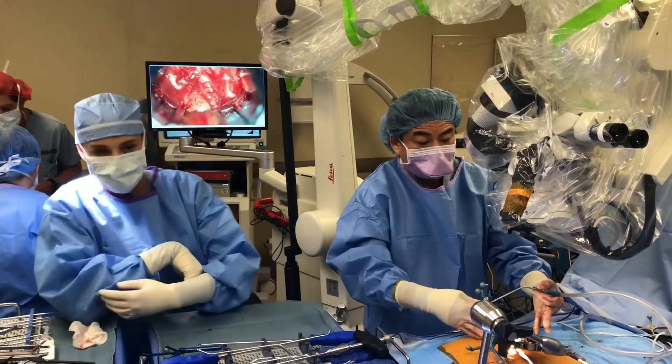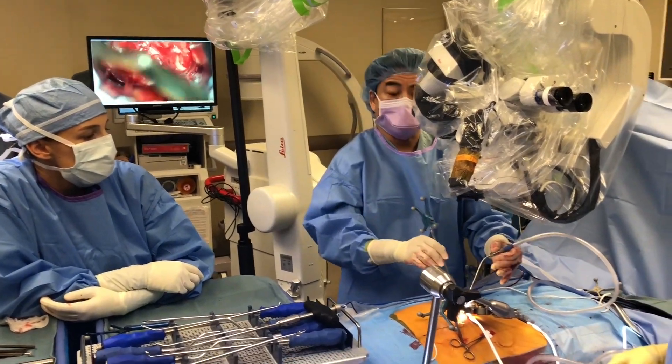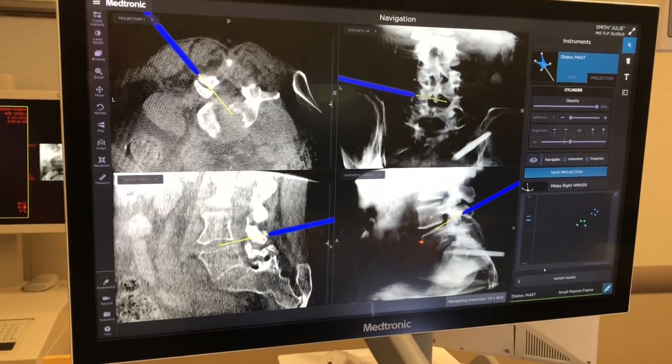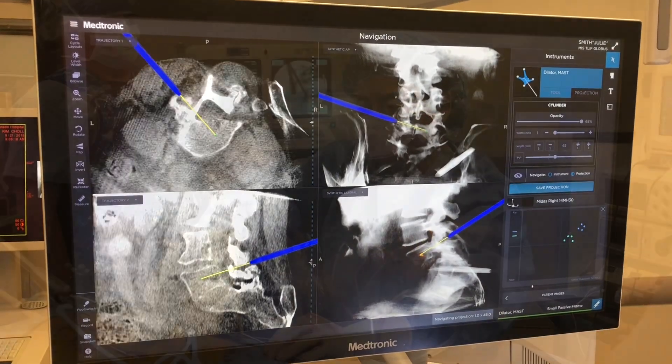We're about to get started. I have the retractor in. We have the 3D image with the navigation tracking pin. This is the navigation probe and I can put it down the retractor and show myself exactly where I am, how angular I need to be to get to the disk space, and I can tell where I am in three-dimensional space at all times.